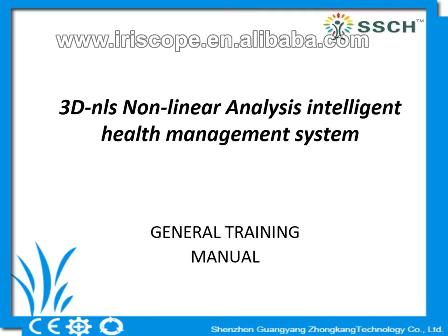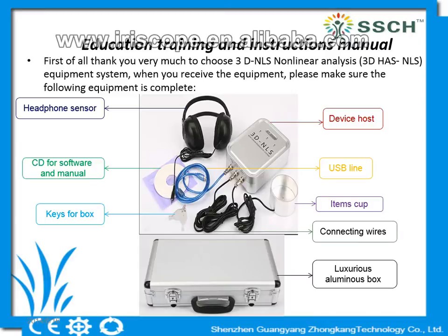Now, let me introduce the menu of 3D NLS. First of all, thank you very much for choosing the 3D NLS equipment system. When you receive this machine, please make sure the following equipment is complete.